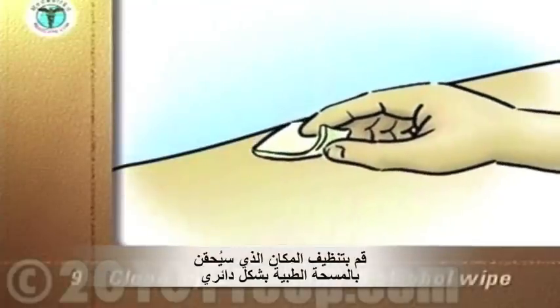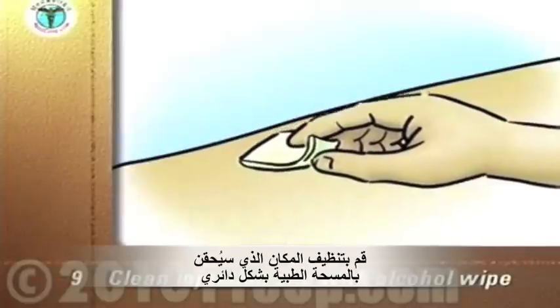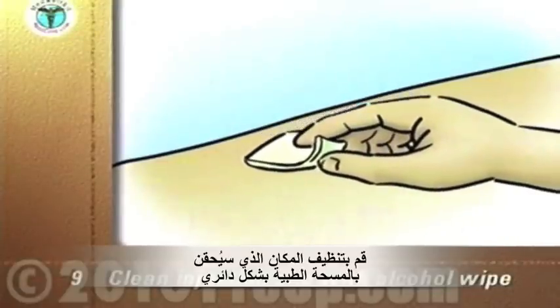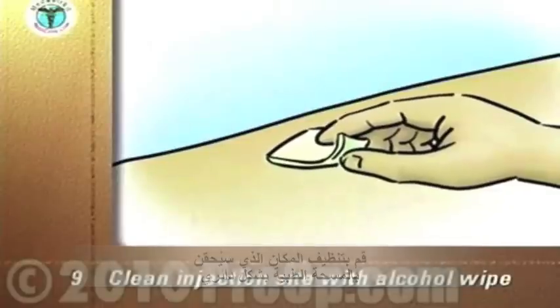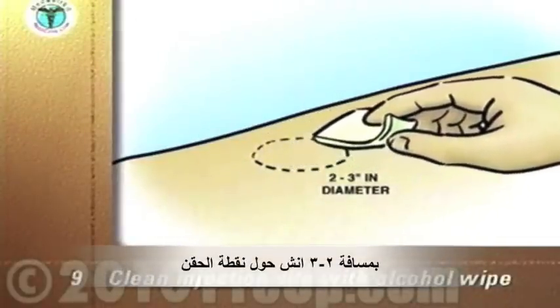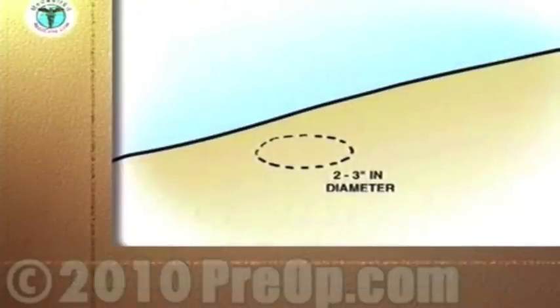Clean the injection site with an alcohol wipe. Start at the proposed site. Wipe in a circular motion moving outward with each circle to prepare an area two to three inches in diameter around the injection site. Let the alcohol dry and discard the wipe into the trash.